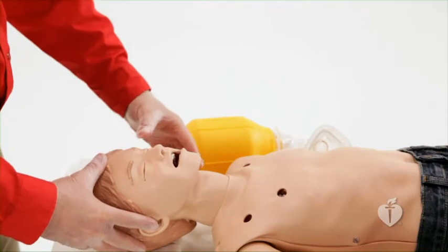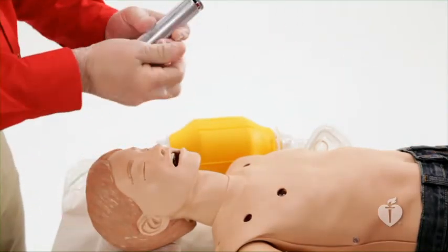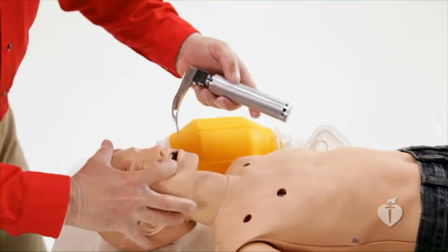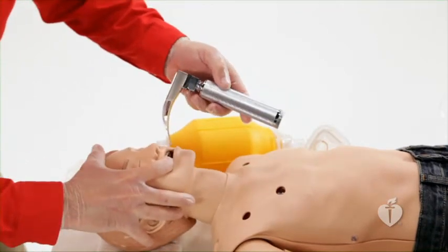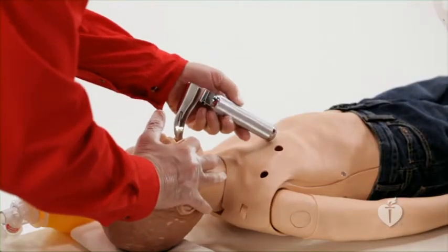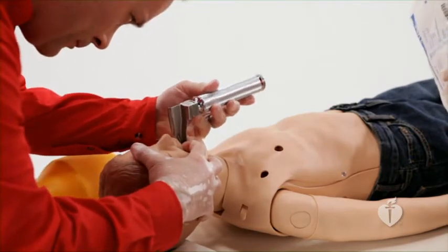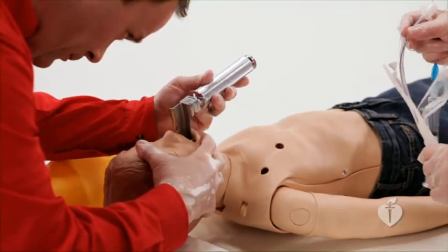Either straight or curved laryngoscope blades can be used. In this demonstration, a curved blade is used. Holding the handle in your left hand, open the mouth using your right hand. Next, insert the blade into the mouth and follow the natural curvature of the pharynx, sweeping the tongue to your left as you reach the base of the tongue.